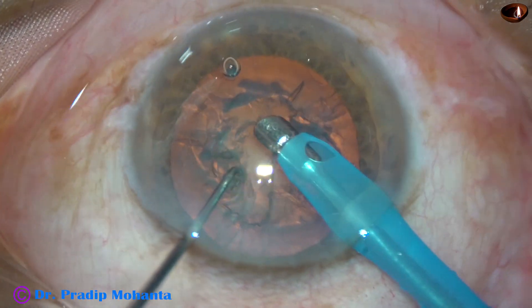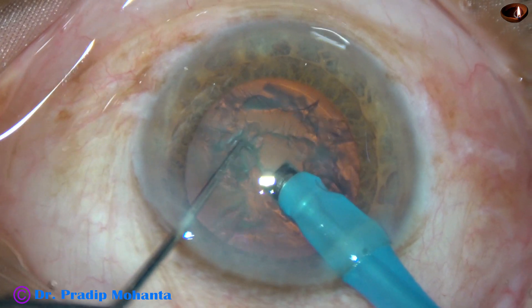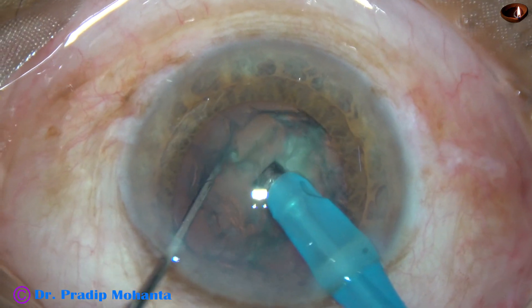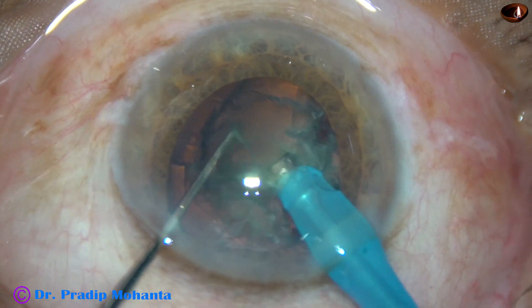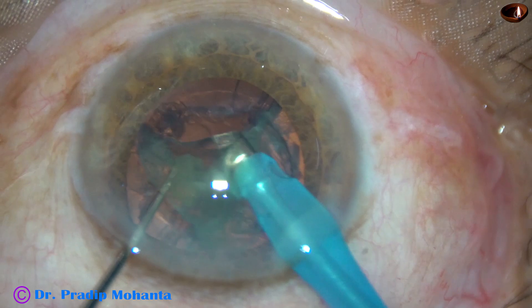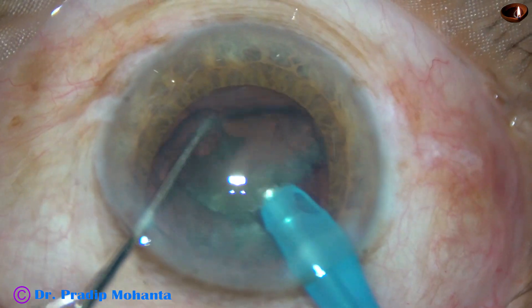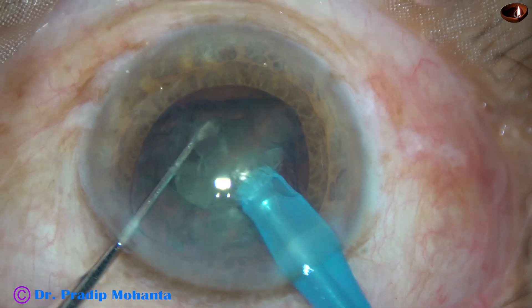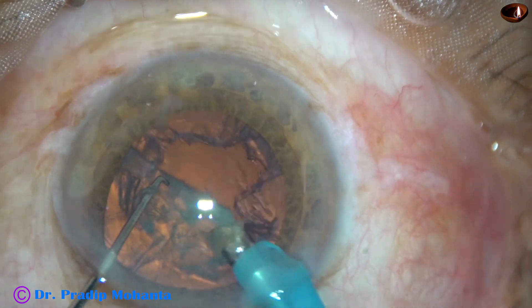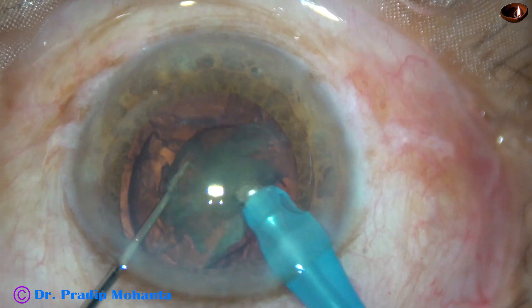Some superficial cortical lens matter is removed. And now the tip is buried into the substance of the nucleus. I remain at the center of the nucleus, where it is possible to hold a nucleus of this density. If we go beyond the central part, the nucleus or lens matter will just be eaten off. So the trick is to be at the central part of the nucleus and use the chopper to slice the nucleus into pieces. One hemi-nucleus has been removed. This is the other hemi-nucleus. It is also chopped and the pieces are emulsified.